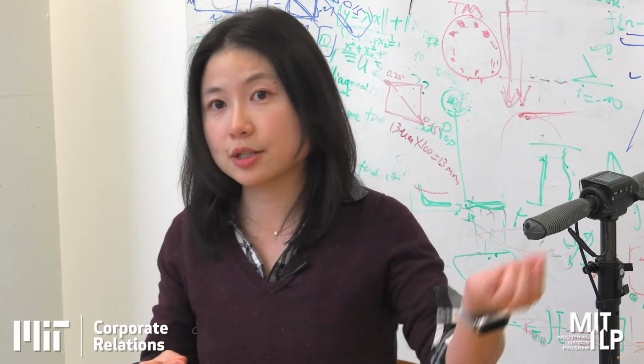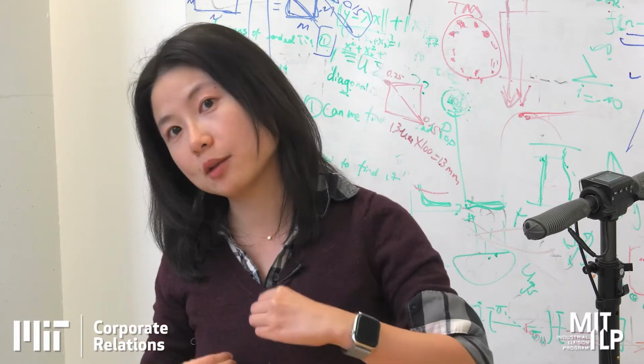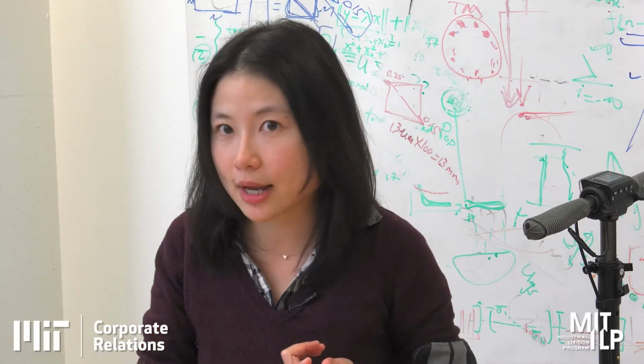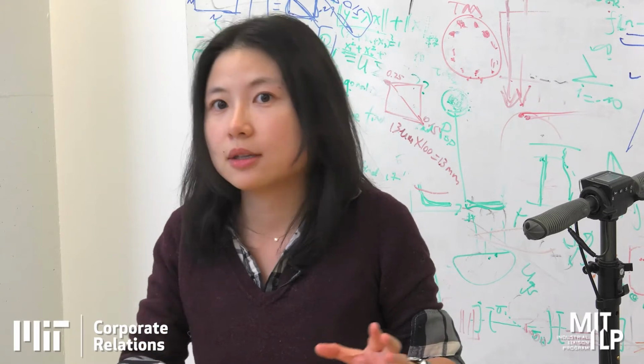You can basically just insert this tiny microscope into the GI tract of the animal and monitor it longitudinally, see how the infection is happening, how the therapy is working. So this way, you can do this drug development in a much more realistic scenario.